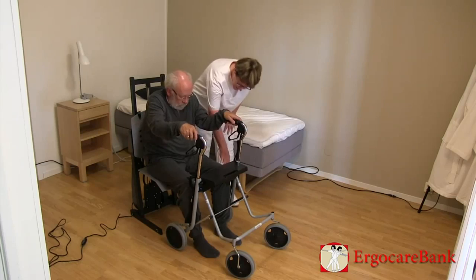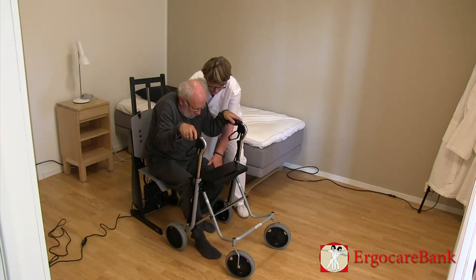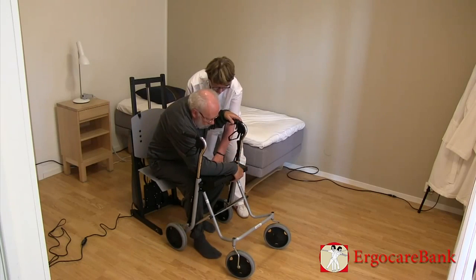Burt is instructed to lean on his forearm on the seat of the walker and push himself up to the side, but he does not understand.